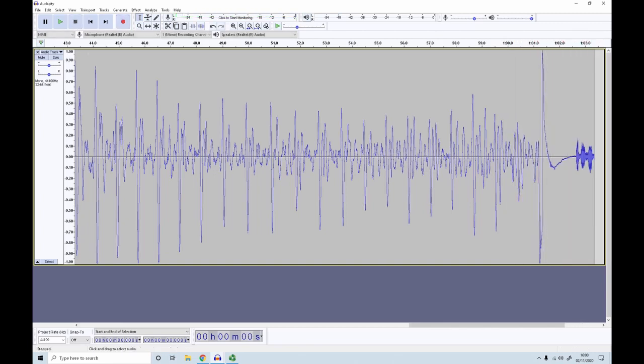Okay, so what you can see here again are regular pulses of pressure being recorded. They're more pressure than really sound because the frequency is relatively low. It's probably below audible frequencies here. But these pulses here are the flow of blood through the artery. And again you can see that this waveform here, it's complicated, but it's very stereotypical. There are again these multiple peaks which repeat with each heartbeat. And again they tell you a little bit about the dynamics of the pressure wave occurring within arteries.